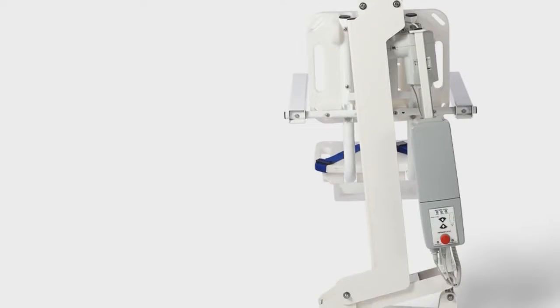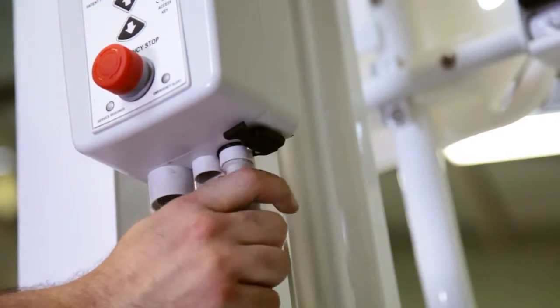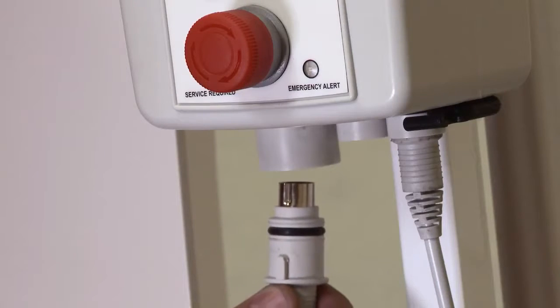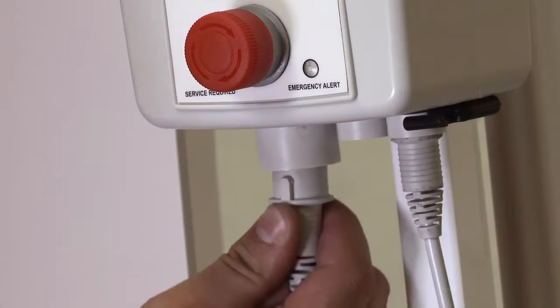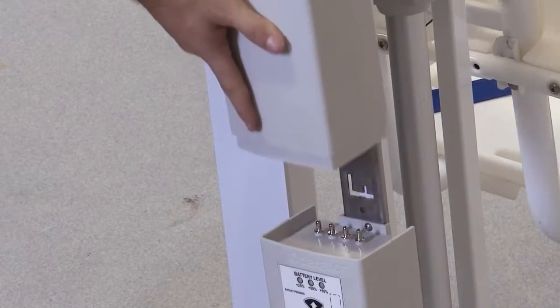The lift operator comes attached to the mast of the multi-lift. Plug the actuator plug into the smaller socket. Next, insert the hand control plug into the large socket on the control box. Now you are ready to attach the battery.